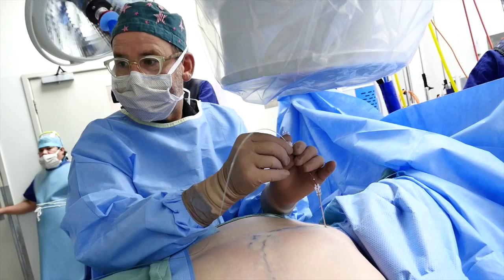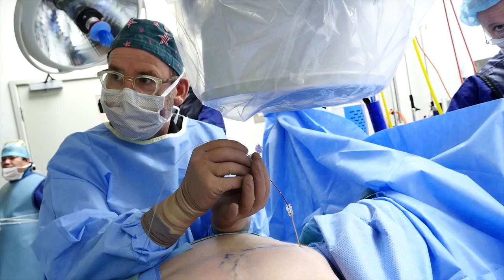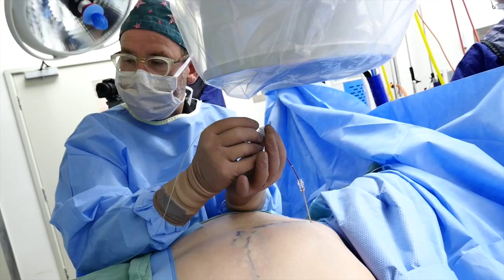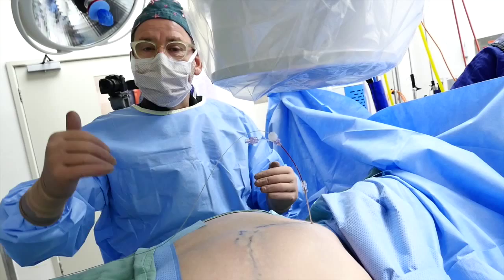What I want to achieve now is to pull the sheath back a little more, then I can feed a little more lead up. You can see the lead going up and making a nice loop, coming back down and buttressing against the lead there in the foramen. At this point everything's looking really quite lovely. I'm going to get that sheath back into the needle, and if you look at his trial leads, we've virtually replicated the exact position we had in his trial with successful stimulation. We'll lock that off there.